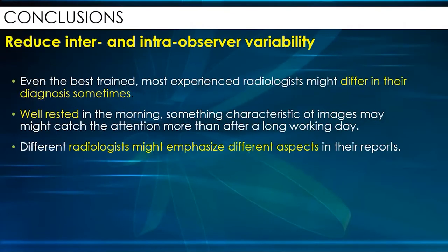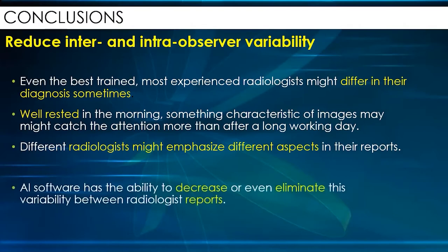Moreover, the main aim of this artificial intelligence is to reduce the inter- and intra-observer variability. Because we know that even the best trained radiologists might sometimes differ in their diagnosis compared with other radiologists. And in the morning, when we are well rested, we may highlight some specific features that cannot be recognized at the end of the day when we are really tired. Moreover, different radiologists might emphasize different aspects in their report. So, AI software today has the possibility to decrease or even eliminate this variability between the different radiologists' reports.